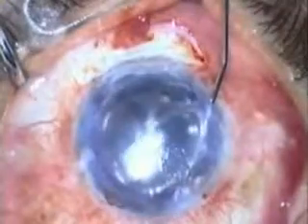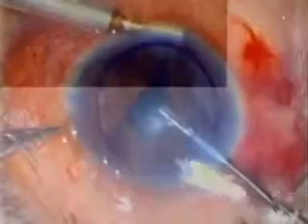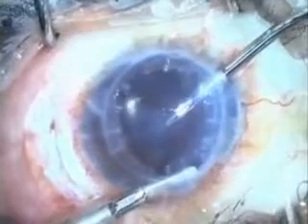The Sheets glide was inserted through the scleral tunnel across the pupillary area to prevent inadvertent injury to the lens. Deep anterior chamber was achieved by injecting an air bubble or saline or using an anterior chamber maintainer. Appropriate sized donor lenticule was placed over the Sheets glide, coated with cohesive viscoelastic device, and was then facilitated inside by either push-in or pull-in technique after centering the donor lenticule to the marked area on the corneal surface.